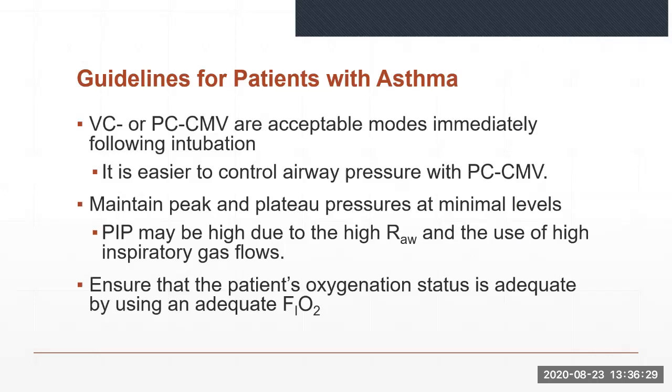Other things to consider, or some guidelines for patients with asthma who are being placed on mechanical ventilation, can be found in the following screens.